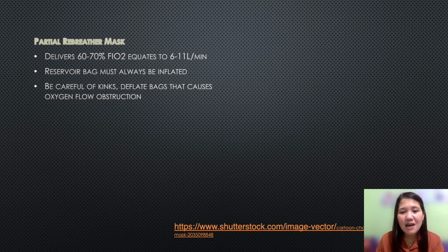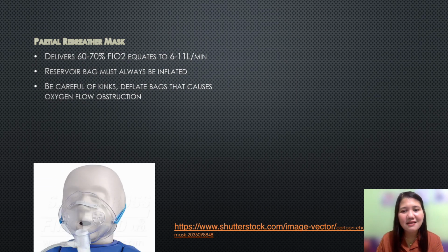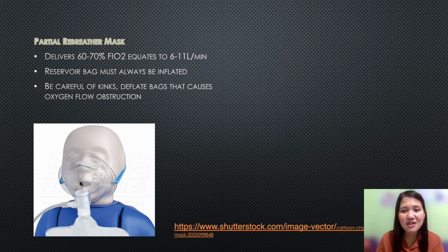As a nurse, make sure that the bag is always inflated by adjusting the flow rate to meet the patient's oxygen needs. The bag might kink, deflate, and obstruct the oxygen flow. So, vigilant monitoring is a must, or if the patient is conscious and oriented, you can educate them regarding this matter, or you can simply inform the patient or significant others to take a look at the bag.